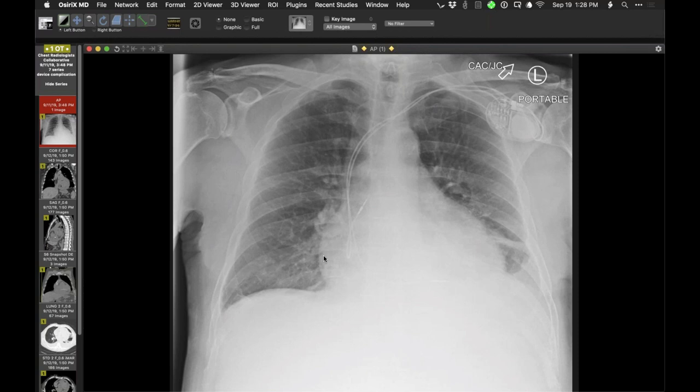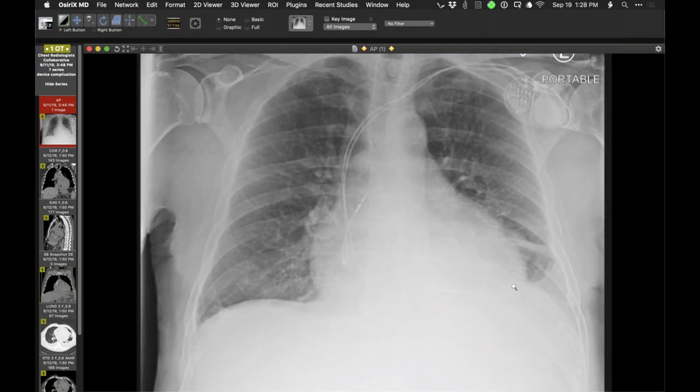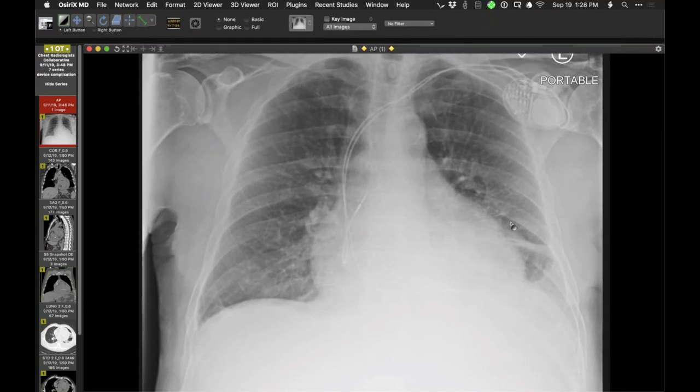Now if you look at that and look at the pacemaker device, just take a look at that for a moment. So assume that we're looking at pericardial fluid, and more than just a little, and that we can ascribe or wonder whether the distended azygos vein, maybe the distended SVC, or at least the distended azygos vein, is because he has pericardial fluid and a component perhaps of pericardial tamponade.